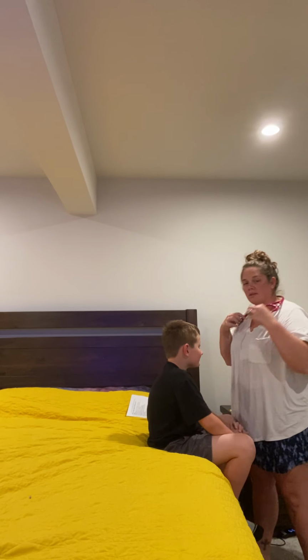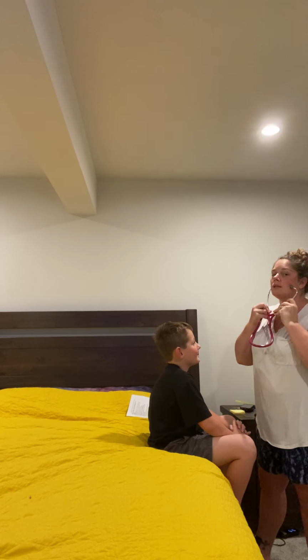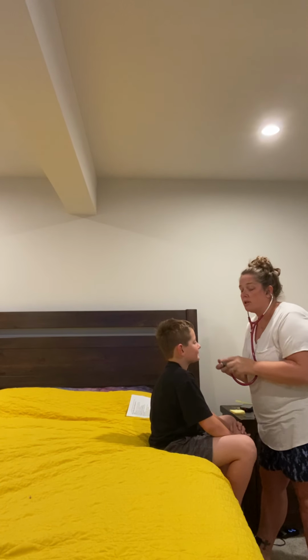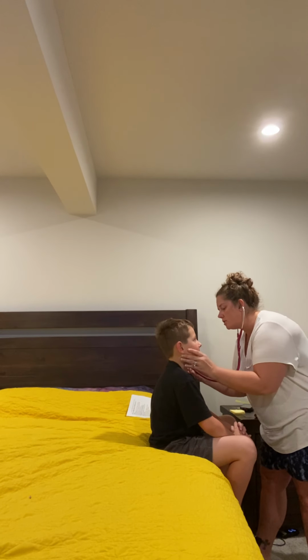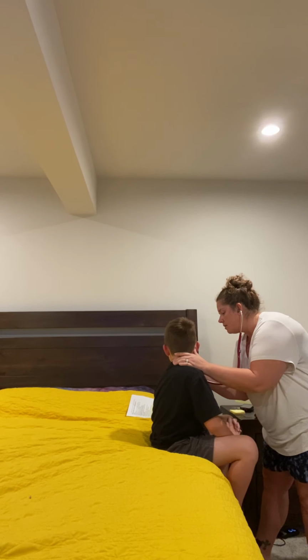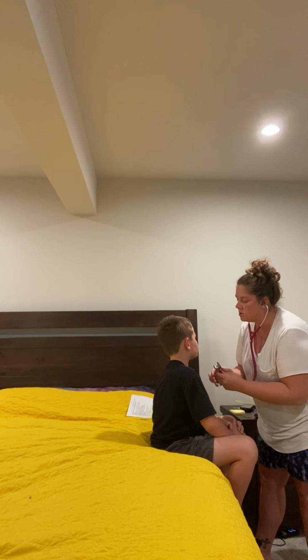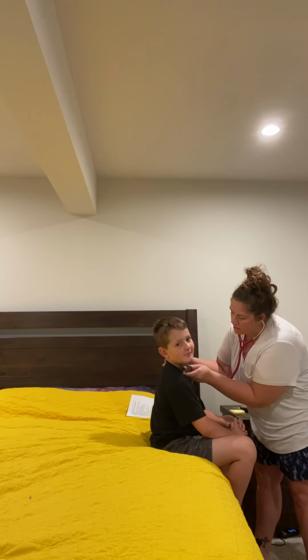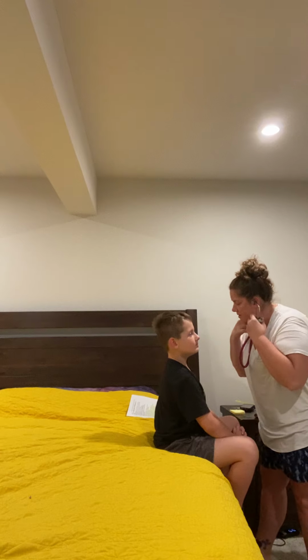Okay, and now I'm going to listen to his carotids to see if there are any bruits, any thrills, and I'm going to listen with the bell of my stethoscope. Go ahead and turn your head this way to your left. Hold your breath. No bruits present. Now turn your head to the other side. Hold your breath. Okay, no bruits present either.